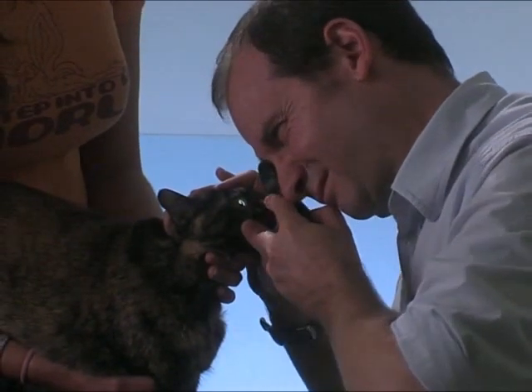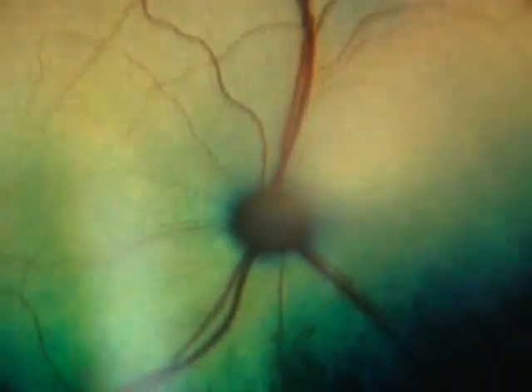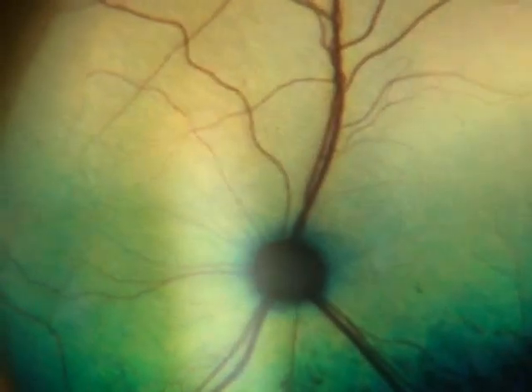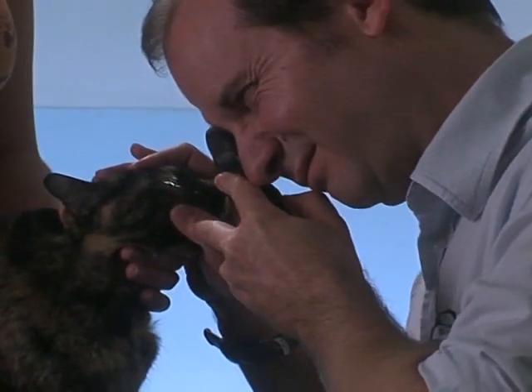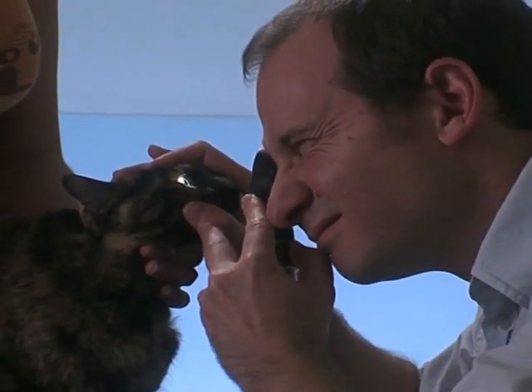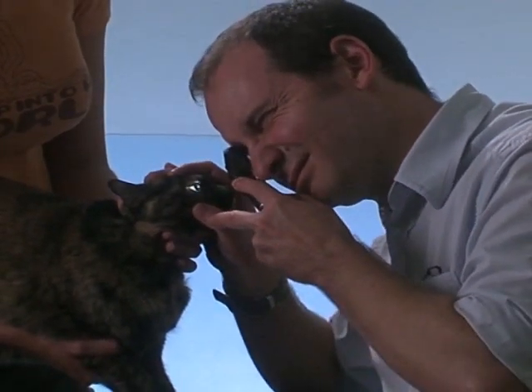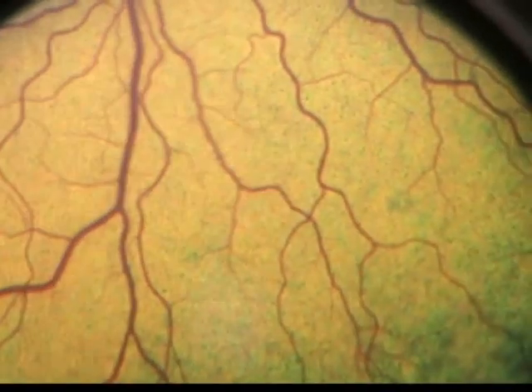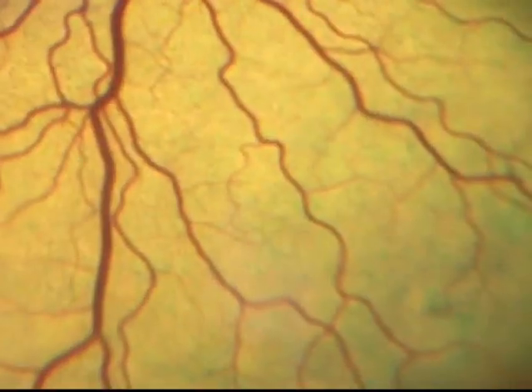When the fundus is in view, begin by finding and inspecting the optic nerve head. Then examine the rest of the fundus as systematically as possible. It's important to have a routine that's going to work for you every time you do an exam. I tend to work from the 12 o'clock position and go in a clockwise direction, looking at each quadrant as I make my way around. If the animal's eye is very mobile, its movements can be used to navigate the fundus.